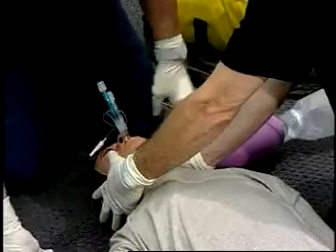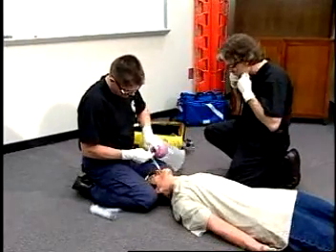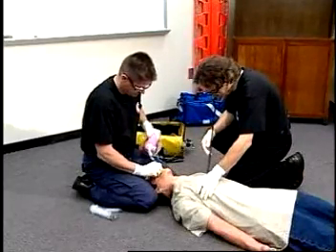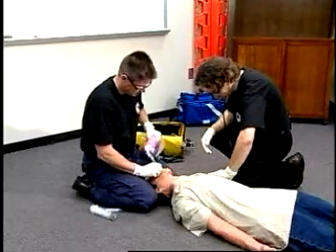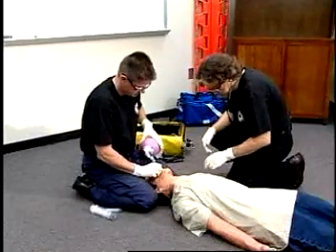Usually, the device will be inserted into the patient's esophagus. To confirm this, begin ventilation through the esophageal tube labeled number 1. If auscultation of breath sounds is positive and gastric insufflation is negative, continue to ventilate with the BVM.